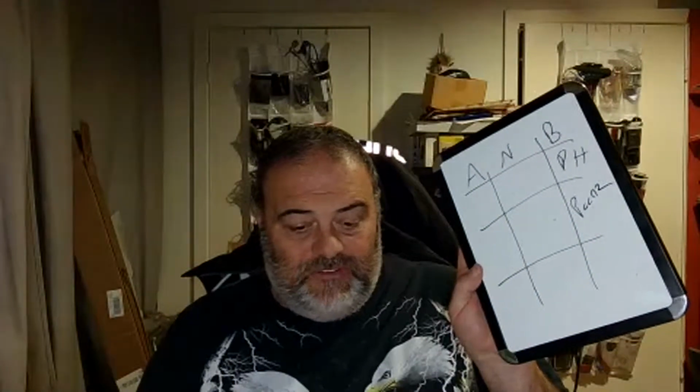And then let's say they have a bicarb of 17. So bicarb is a base. So more of the base is more alkalotic, less of the base is more acidotic. So that's going to put that patient right over here because there's not as much base as needed.